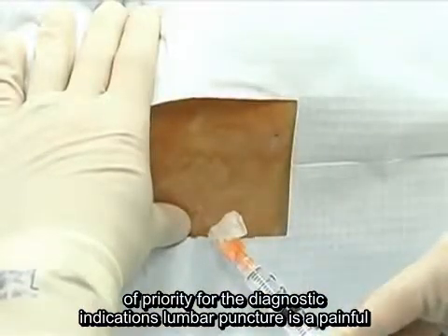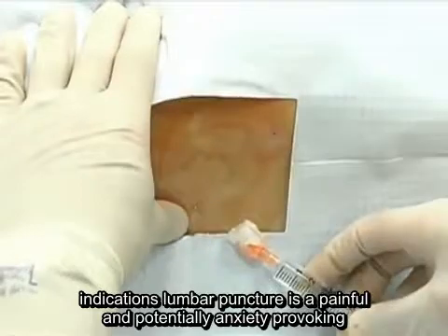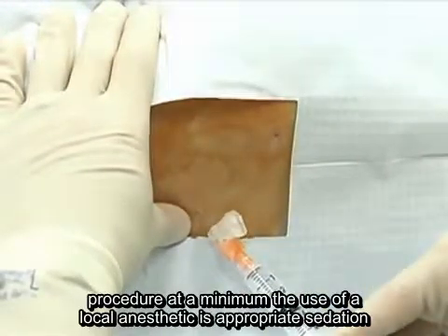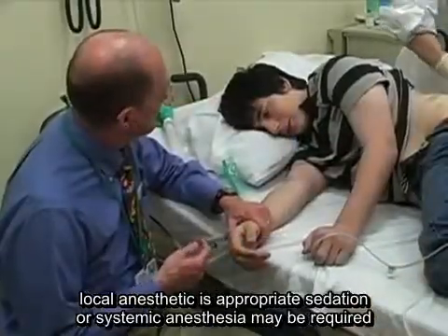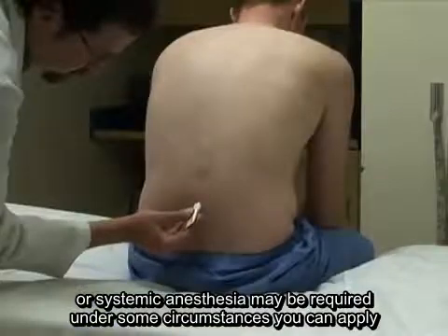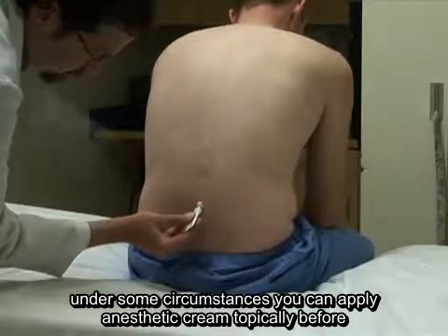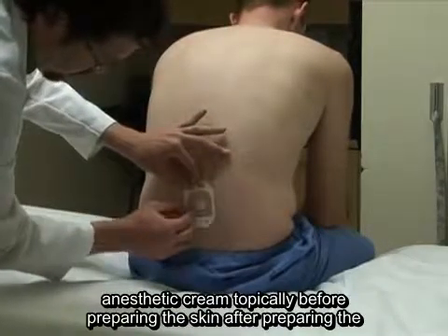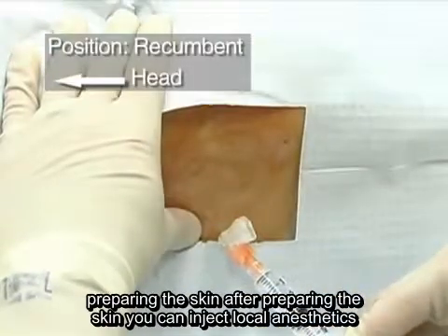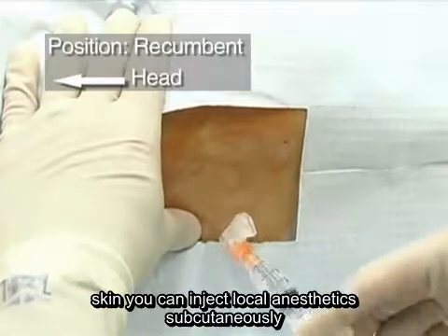Lumbar puncture is a painful and potentially anxiety-provoking procedure. At a minimum, the use of a local anesthetic is appropriate. Sedation or systemic anesthesia may be required under some circumstances. You can apply anesthetic cream topically before preparing the skin. After preparing the skin, you can inject local anesthetics subcutaneously.